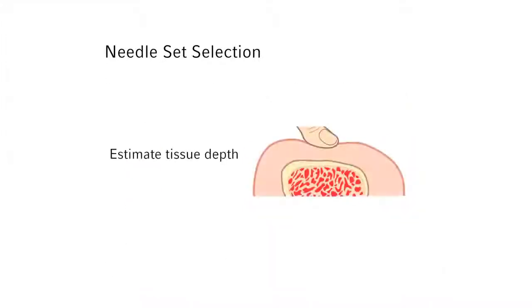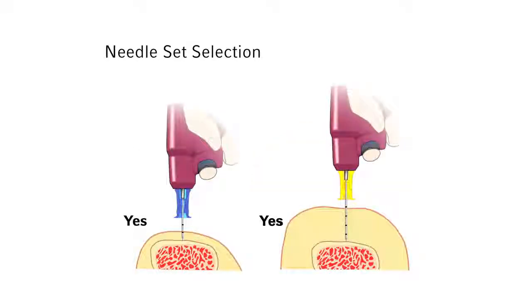Press your thumb or finger over the insertion site to estimate the depth of soft tissue. With the needle set tip touching the bone, the 5 mm mark must be visible above the skin for confirmation of adequate needle set length prior to drilling.